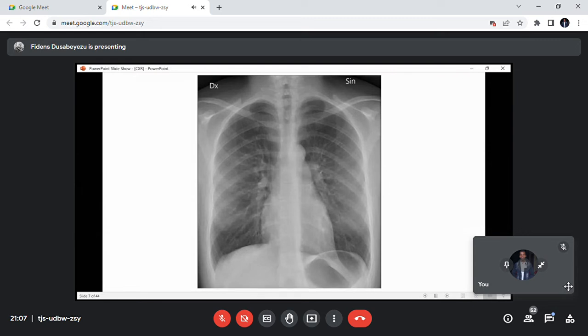Again, before I continue to the lungs, number two, I want to tell you something. In radiology we use what is called the 4S. S as a letter. S number one is about size. S number two is about site, location. S number three is about shadow as opacity. And S number four is about shape. Voila.